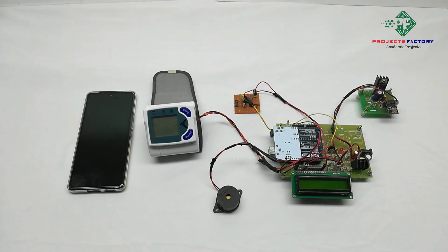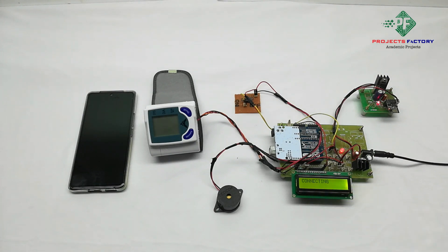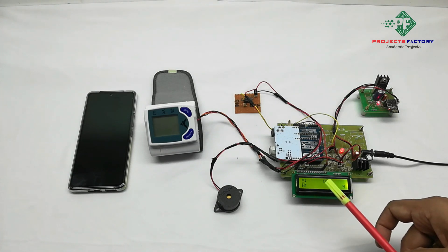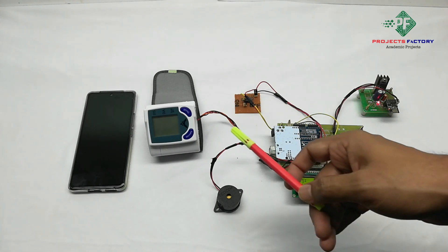Now power on the device. Wi-Fi is connecting. We can see here on the LCD: S means systolic, D means diastolic, H means heartbeat, and R means the device is ready.